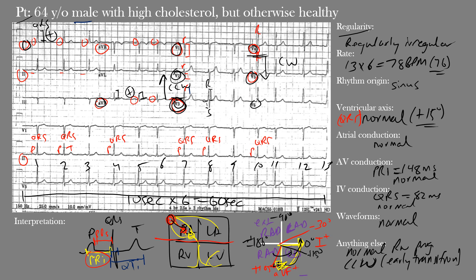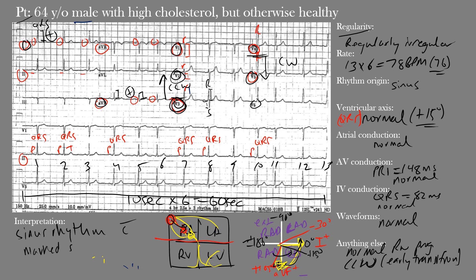So what is our final interpretation? We have a regularly irregular rhythm with sinus origin, occurring at a normal rate with a normal axis, along with normal atrial, AV, and IV conduction, and no major waveform abnormalities. This is a case of sinus arrhythmia — specifically sinus rhythm with marked sinus arrhythmia.